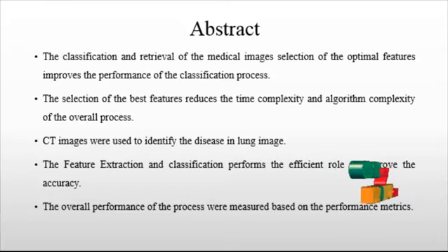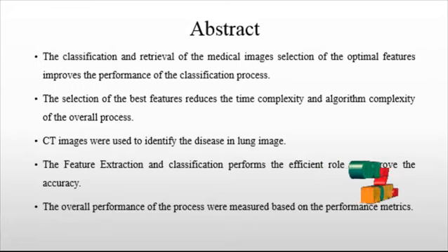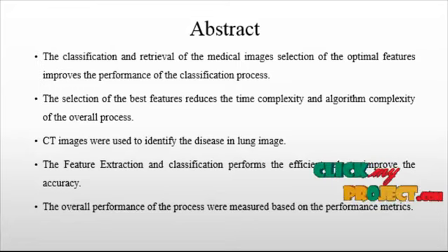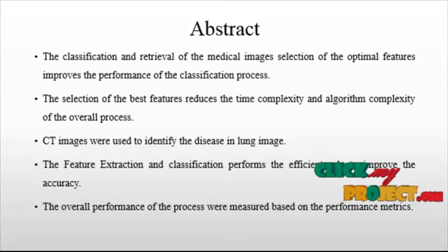They were evaluated with and without supervision from textual distance, using a database of computer tomography scans of patients with interstitial lung diseases. The proposed method consistently improves the CBIR mean average precision, with improvements that can reach 38% and more marked gains for small annotations, given the overall availability of radiology reports in picture archiving and communication systems. So the proposed approach can be broadly applied to CBIR systems in different medical problems and may facilitate the introduction of CBIR in clinical practice.